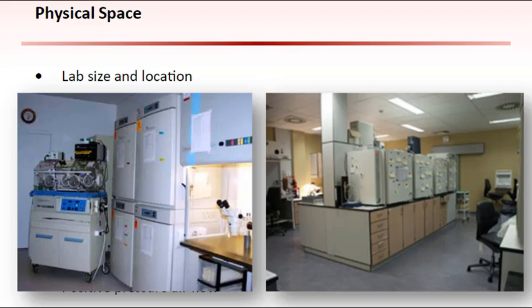In an effort to create a cleaner environment, most IVF labs are designed as positive pressure environments, such that the air pressure inside the lab is greater than the air pressure outside. This ensures that when the laboratory door is opened, air moves from inside to outside the lab, reducing the risk of inner air contamination. An easy way to determine if the air pressure is higher inside than outside is to place a small piece of paper on the floor near the door. When the door is opened, the paper should move out the door rather than being pushed further into the room by the door opening. Generally, the embryology laboratory should be the center of the filtered air environment. Clean air should then move out from the embryology laboratory through the procedure rooms.